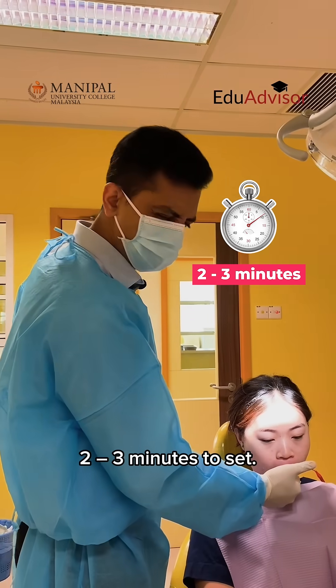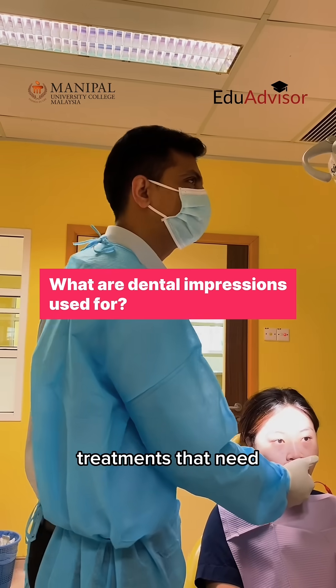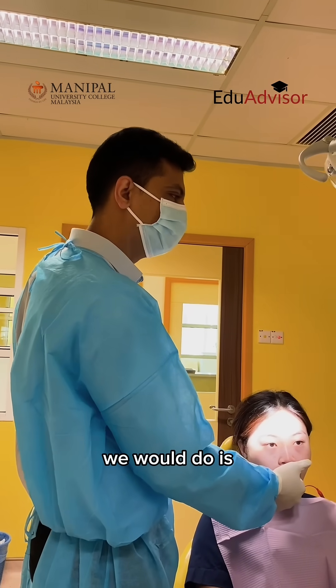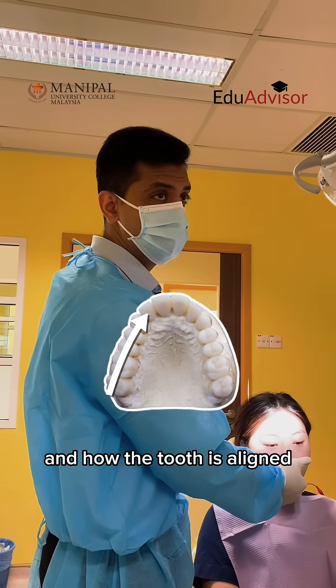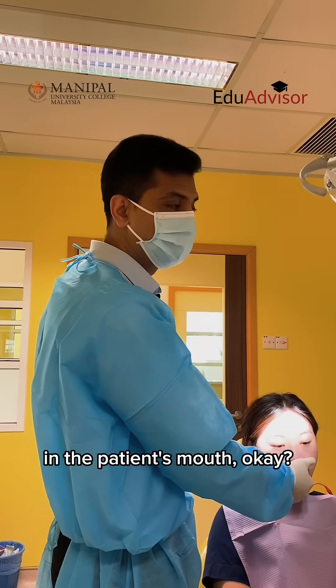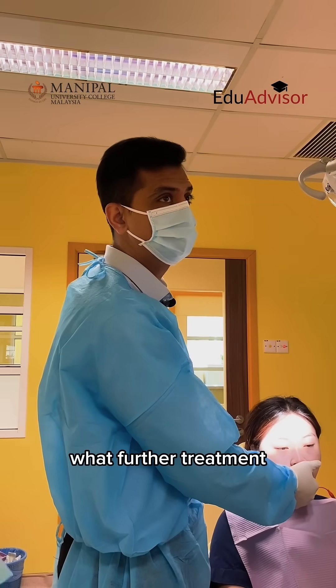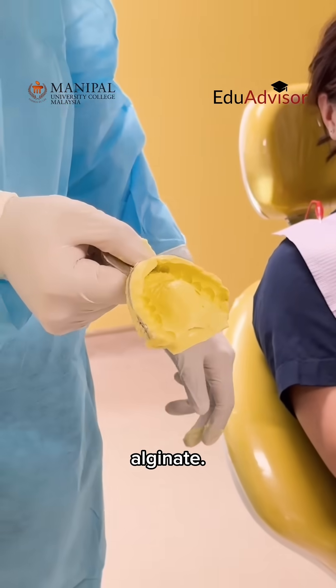This will take about two, three minutes to set. Once it's done I'll snap it out of the patient's mouth. There are a lot of treatments that need impressions to be done. One of the basic ones is to analyze how the arch is and how the teeth are aligned in the patient's mouth. That's more of a diagnostic so we can plan what further treatment can be done. So that's the impression we make with the help of the alginate.